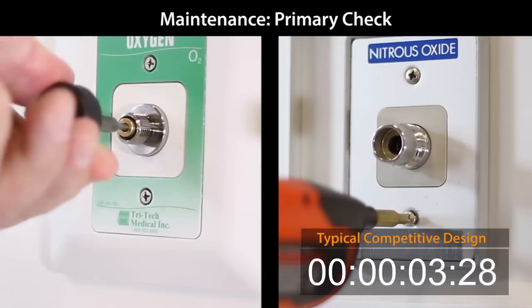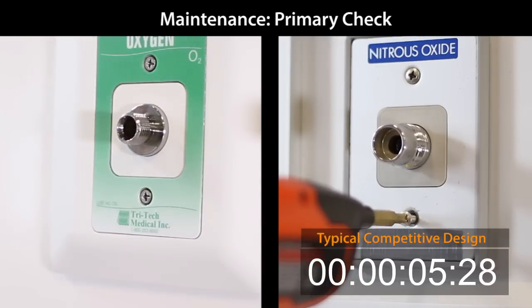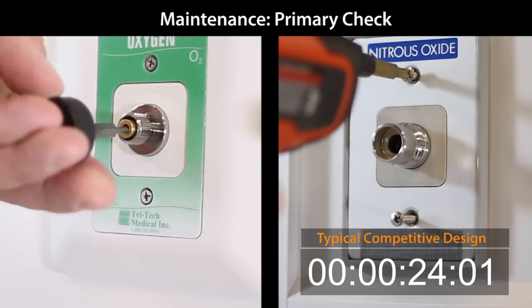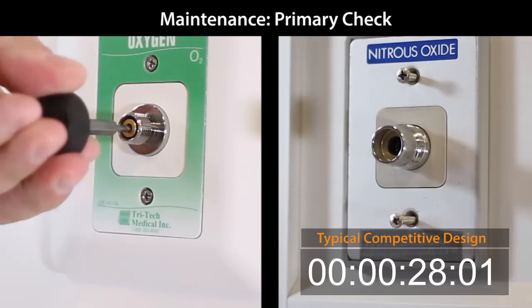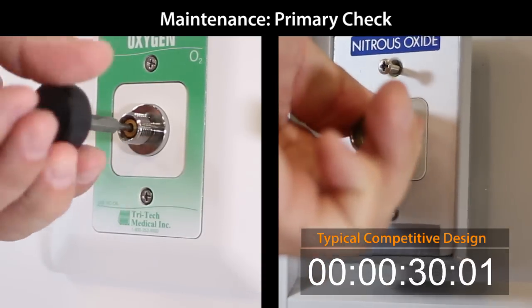Maintenance primary check. With the Tritec DISS outlet, maintenance of the primary or front check valve has been minimized. The primary check is simply unthreaded from the outlet and replaced without removing the latch valve assembly.